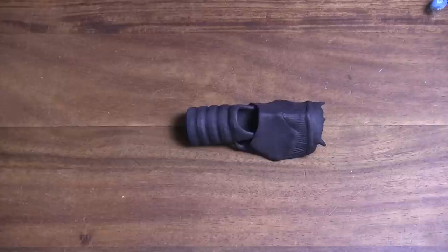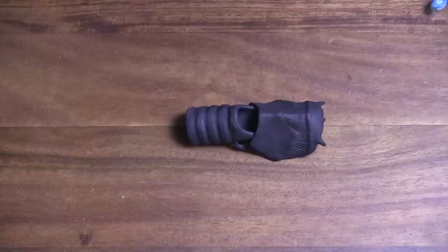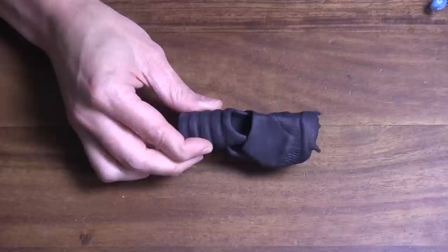All right folks, I'm going to take you through how to use this 3D printed crike model to practice crikes at least once a month to lock in the skills. Now, here's the model. And if you don't know where this is, just go to the show notes for this week and you'll find Laura Duggan's amazing free model.